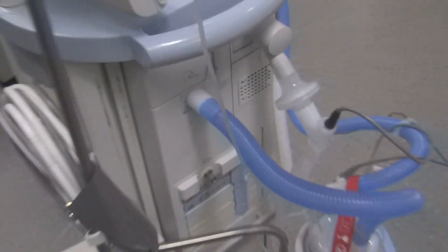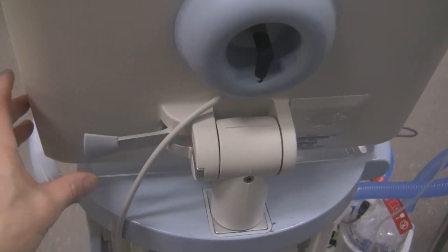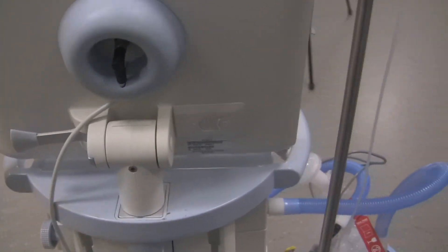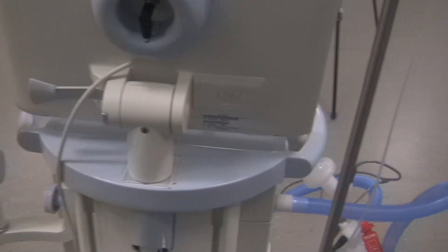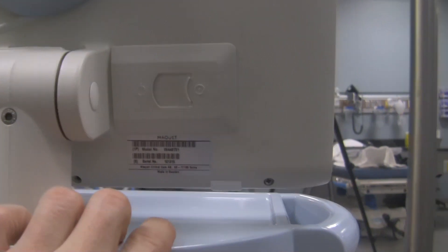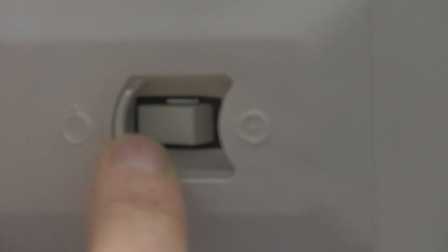At the back of the unit, behind the screen, there's a tab for adjusting the display forward or backward. There's also one in the front for swiveling the display left or right. An important feature on the back: the on-off switch is located right here — it's a simple toggle or slide. To turn the ventilator on, just push it, and to shut it off, do the opposite.